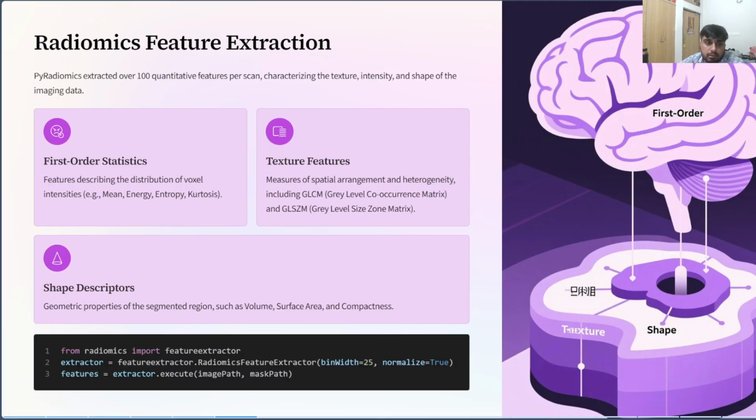With the standardized images that we now have of both, we can move into the heart of this project, that is feature extraction, for which I used the PyRadiomics library, which implements the IBSI standard definitions of radiomic features. For each volume, PyRadiomics computed several categories: first order statistics such as mean, variance, energy, and entropy; texture features like GLCM, GLRLM, GLSZM, and GLDM matrices capturing spatial intensity relations; and shape features, which describe the 3D geometry of the area. Each scan ultimately yields over 100 features, effectively transforming every image into a numeric vector.